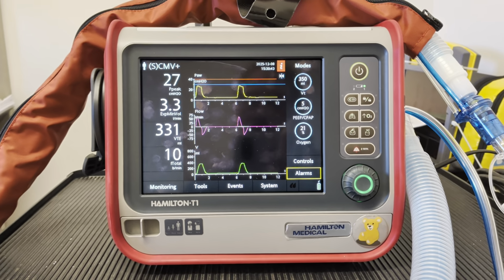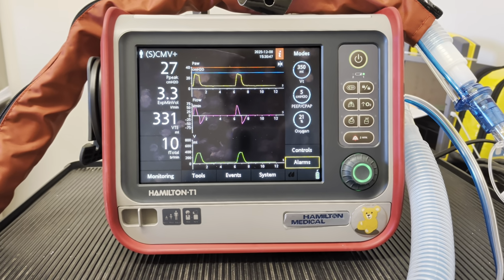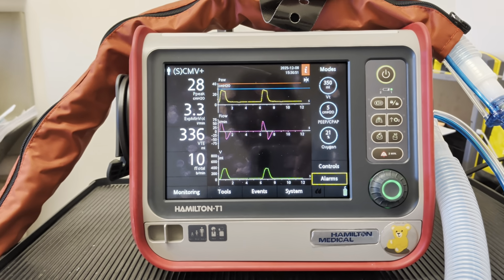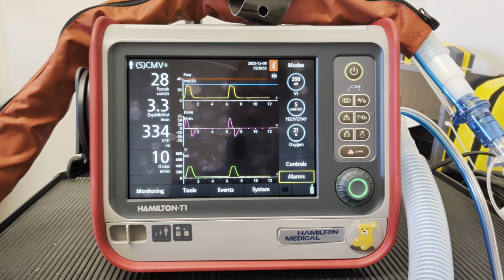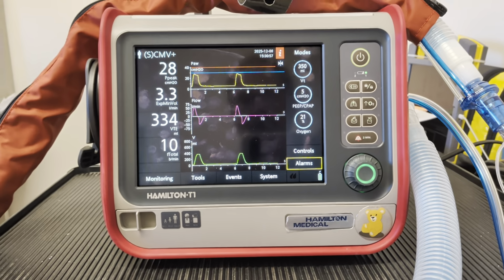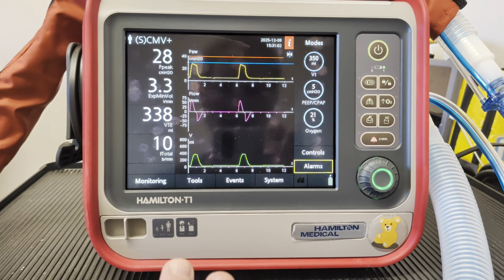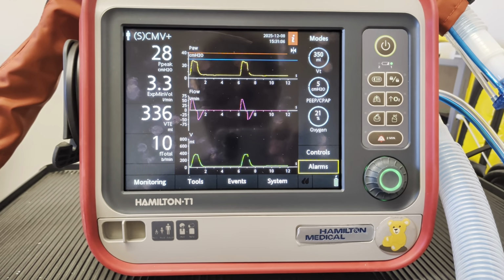So we're attempting to better oxygenate the patient. And then the third category is ventilatory issues, right? We're attempting to blow off CO2. We're attempting to ventilate the patient better. I'm going to talk a little bit more about the synchrony aspect in subsequent videos, and so in this video, I'm going to focus primarily on oxygenation and ventilation.